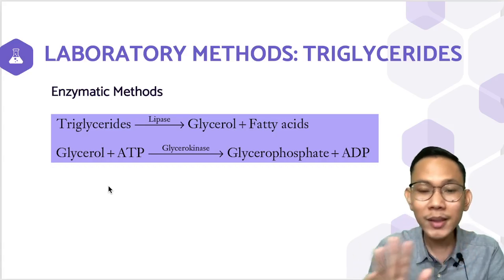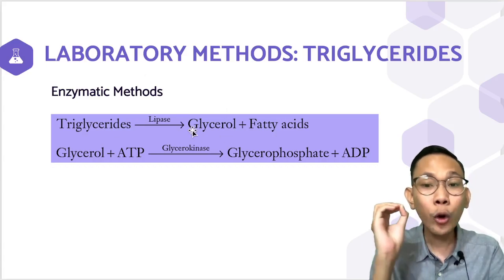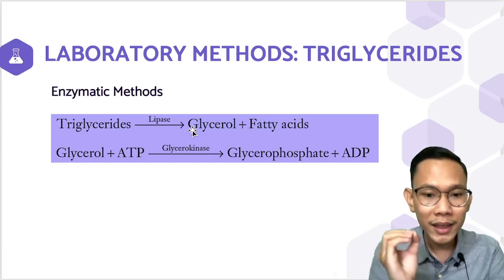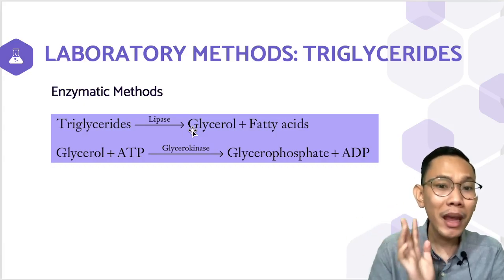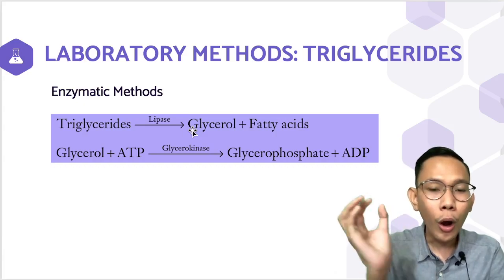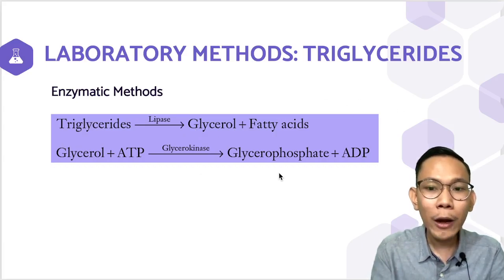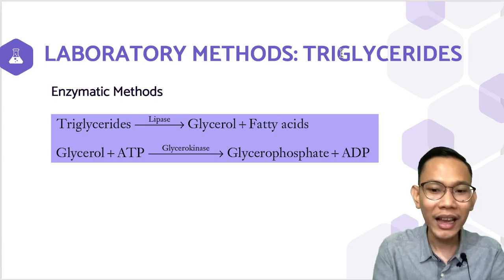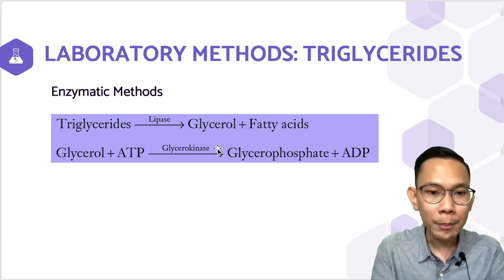Sa lahat ng methods na i-discuss natin later on, these are the first steps that are common with all of these methods. Again, confused kayo, no? Maraming method or enzymatic method to detect your triglycerides. Among all these methods, lahat ng methods na to, ito talaga ang pinaka-umpisa nilang lahat. Ha? Again, that's very clear ha. These are the first two steps that are common among these methods.